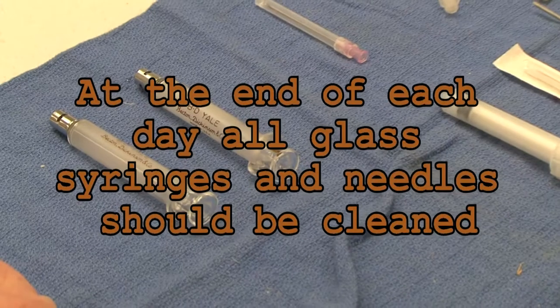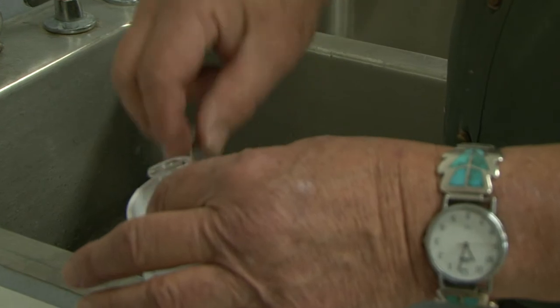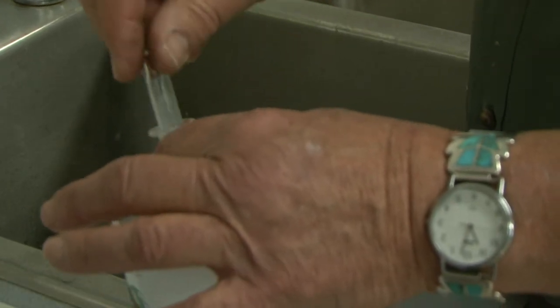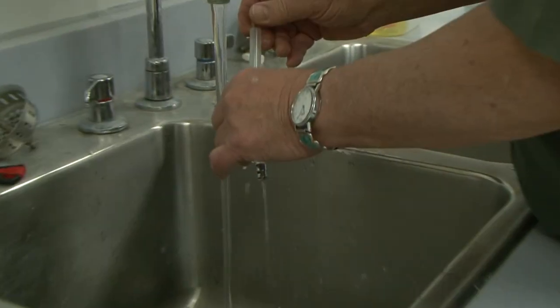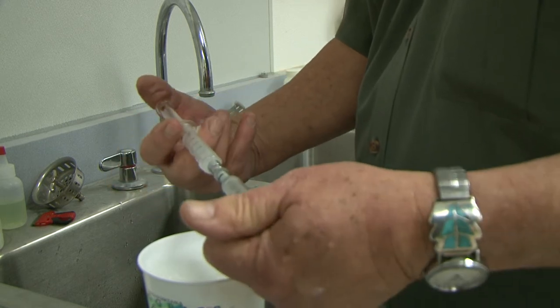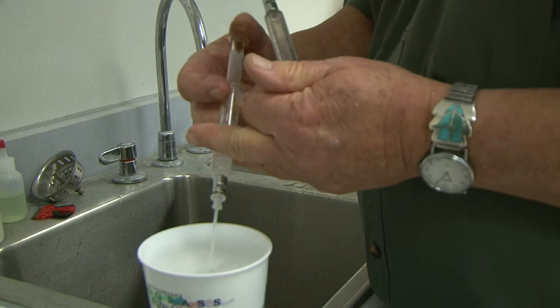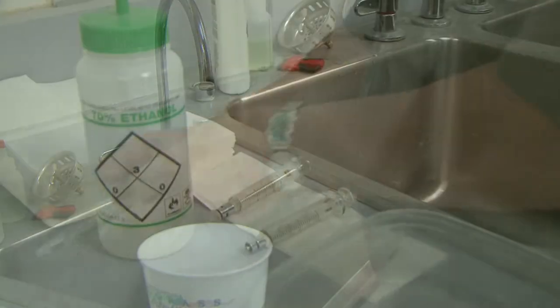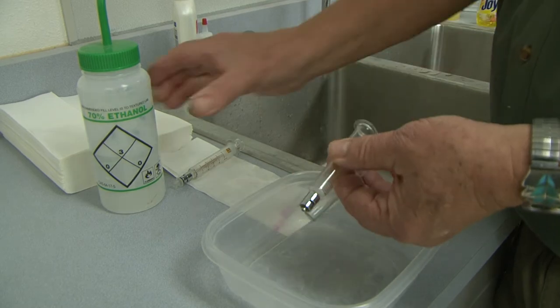At the end of each day, all glass syringes and needles should be cleaned. All this equipment should be rinsed in hot water, then in soapy water, and then in hot water again. It helps if you connect the glass syringes and push soapy water back and forth just as you did when mixing, but this alone will not remove all the oil residue from the adjuvant. A final rinse in 70% ethanol or isopropyl alcohol will remove the remaining residue.